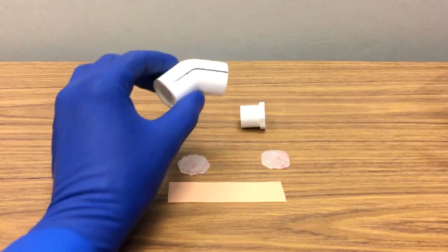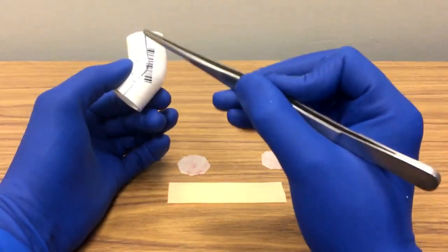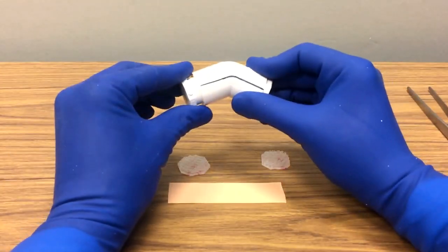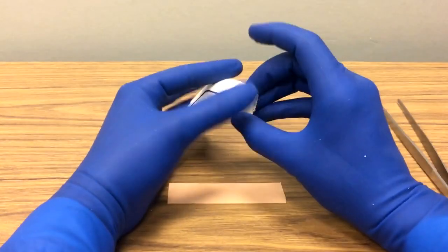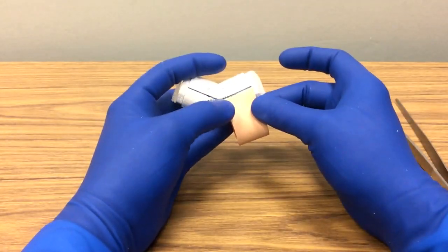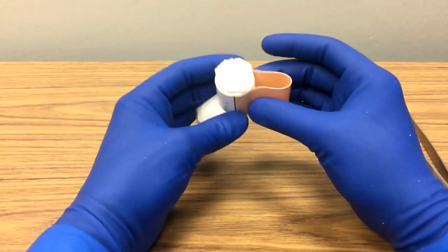The same insert is used for tasks 1 and 2. A line is drawn down the middle of the 45 degree elbow on both sides. Half-inch plugs are pushed into each end of the pipe, and square fasteners are placed on each end. A 9 centimeter length of waterproof tape is placed on the insert, lining up each end with the black lines and squeezing the tape together.